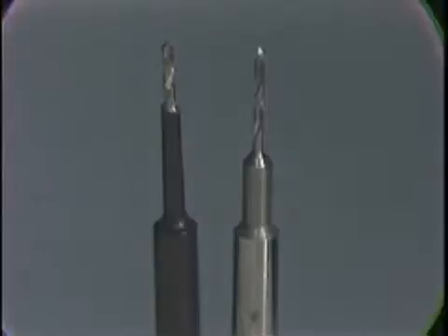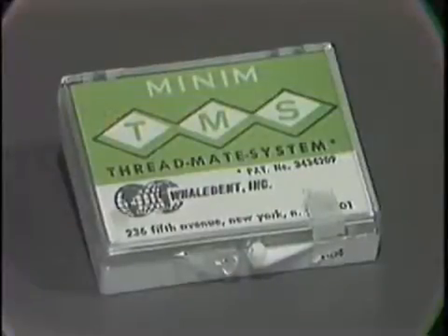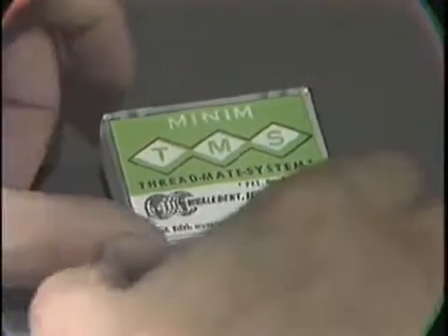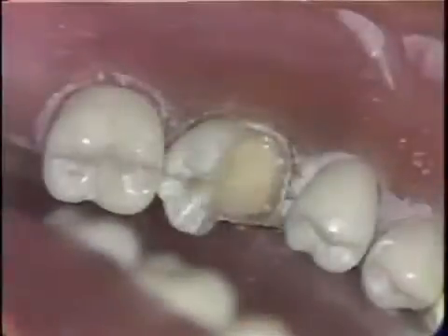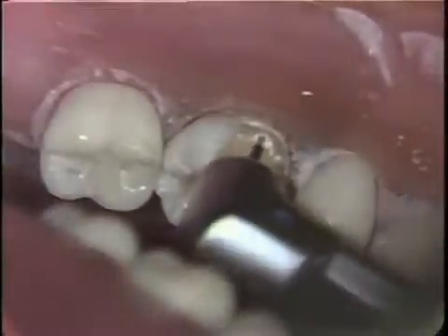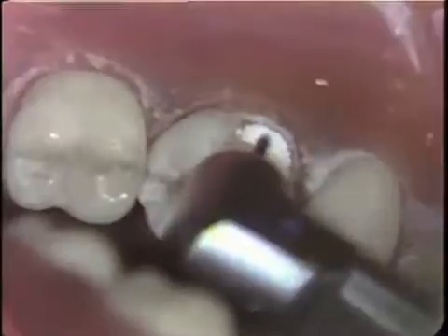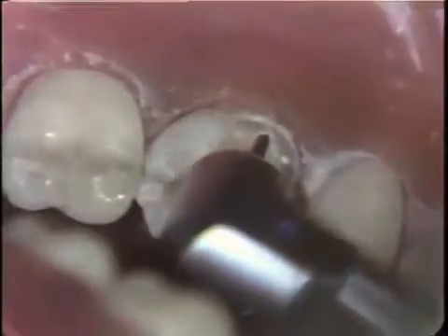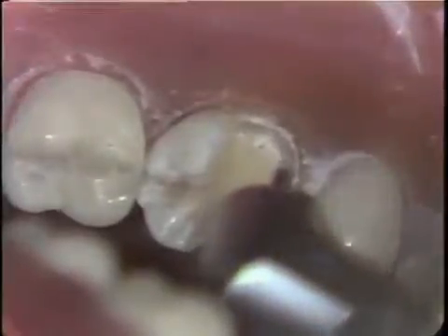A pin hole which is five millimeters in depth can be placed into the tooth with the non-self-limiting drill. This is the TMS Minim Pin Kit as supplied by the manufacturer. Inside it we have the twist drill, the wrench, and the pins. The self-limiting twist drill supplied with the kit is used to drill the pin holes. The twist drill is placed into the dimple and with a pumping in-and-out type of motion, the pin hole is drilled. Upon completion of the first pin hole, which is placed to a depth of three millimeters, the other pin holes are now drilled.